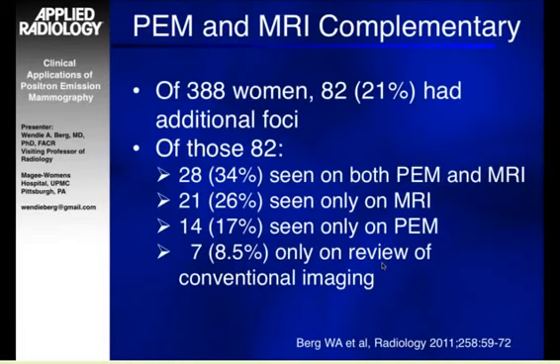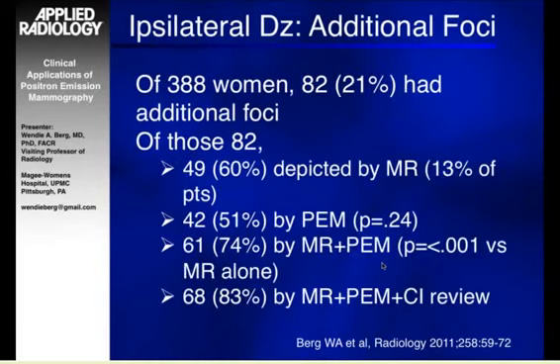So having the person who's interpreting the PEM also be a person who's a breast imager who can look at the breast imaging with the PEM is actually going to be very important to improving overall performance characteristics. At some centers, I know nuclear medicine physicians are involved in the interpretation, but I would just encourage any centers that are doing PEM or contemplating doing PEM to also have involvement of the breast imagers at a minimum.